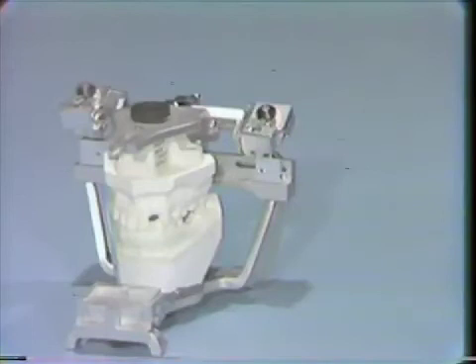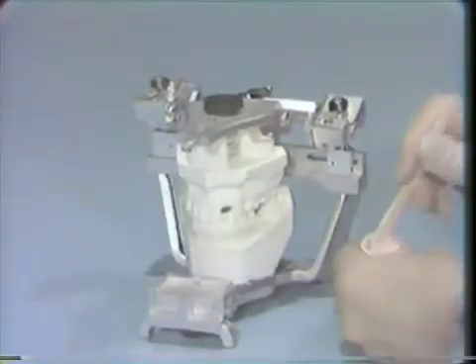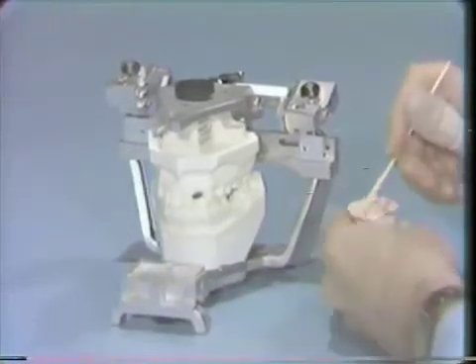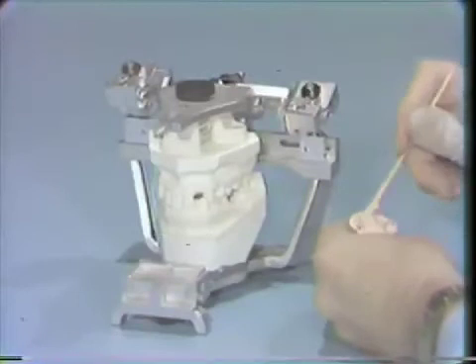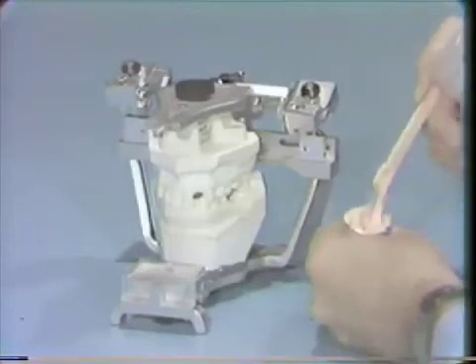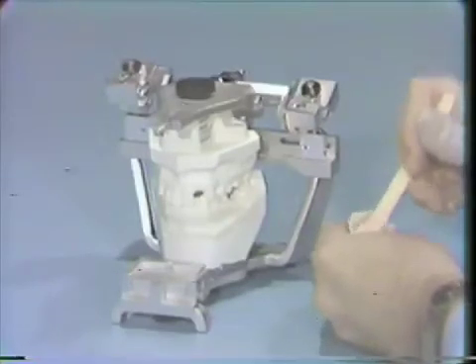We are now ready to make our platform for our functionally generated registration, and again we will be using the TMJ acrylic material for the reasons previously stated. We've begun to mix it already, and we'll have to wait till it establishes itself to a little more solid consistency, and then we'll make it up into a rectangular shape and place it over the teeth and instruct the patient to close into centric occlusion.